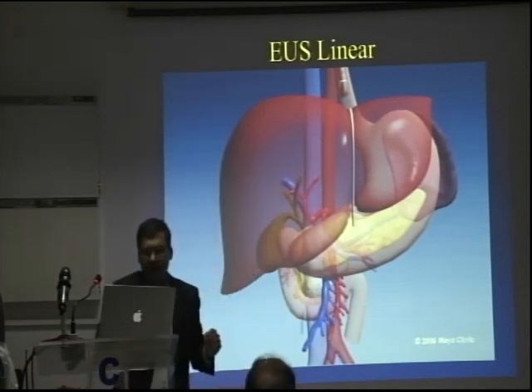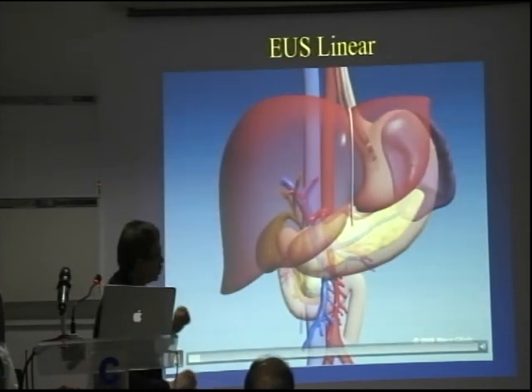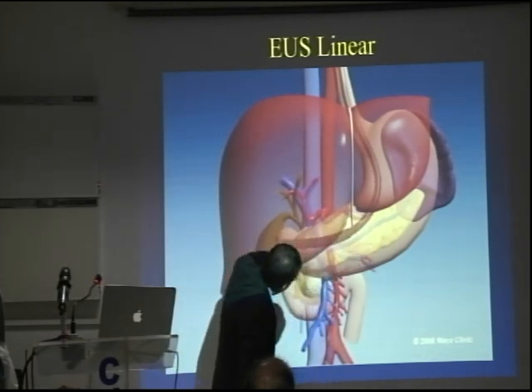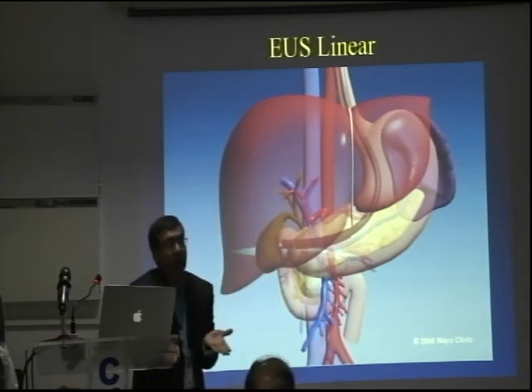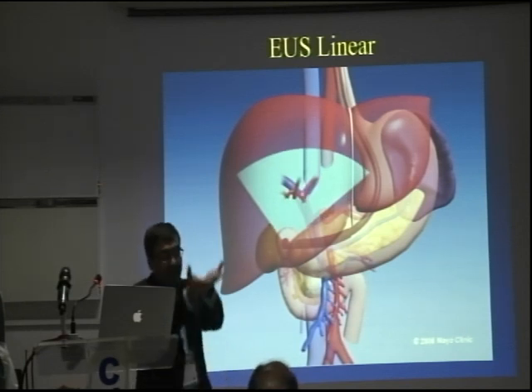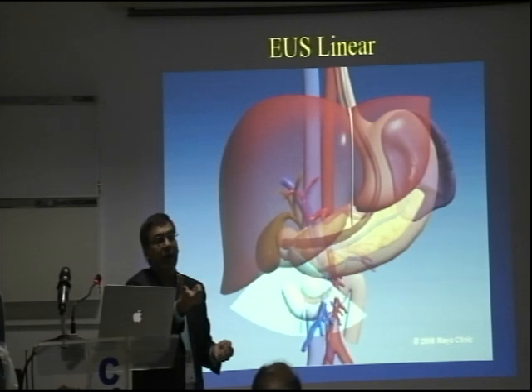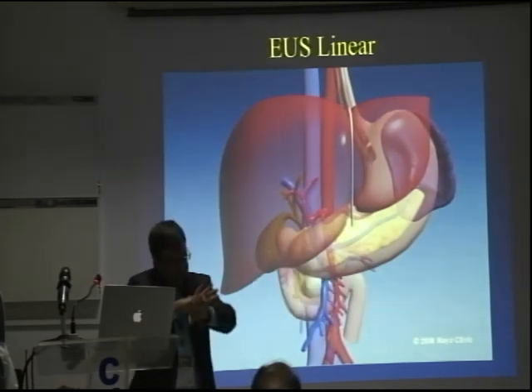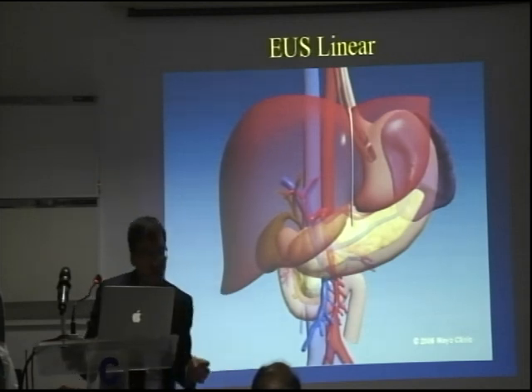When you go to the duodenal bulb, you have to rest at the greater curvature, and it flips. So everything flips, like you're looking upward now. You are down, and you're looking at the structures upward. That's why the portal vein flips: the bile duct comes first and the portal vein second. I'll demonstrate that in a live case and show you what I mean.